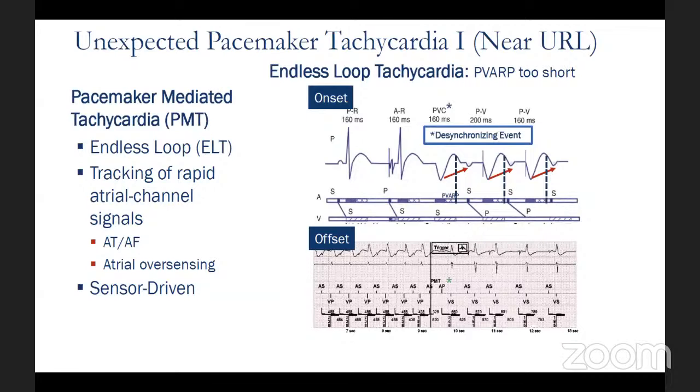The other thing, sometimes we have patients with first-degree AV block, and they get a very long PR interval. Sometimes that also confuses people. So that's another thing that we think about when we use this kind of mode, MVP or VIP.